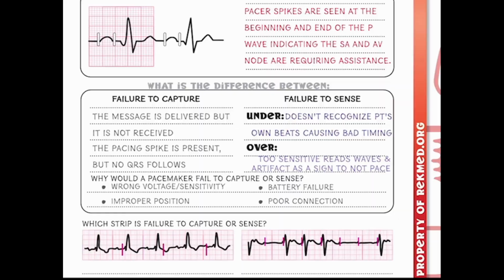So think of this like a vacuum. If you're plugging it into the outlet in your wall and you're sweeping along and all of a sudden it comes loose out of the outlet, the vacuum's going to stop. So there's that poor connection. But once you go and shove it back into the outlet a little further in, everything starts working again. And before we go, we're going to have these two rhythms that are determining which problem it is.